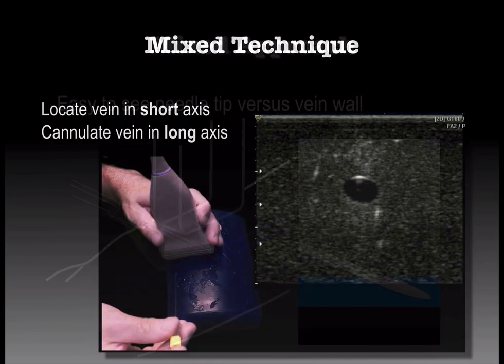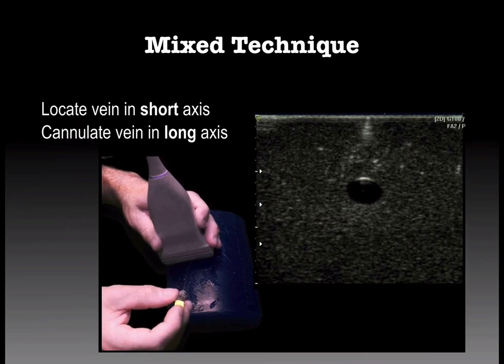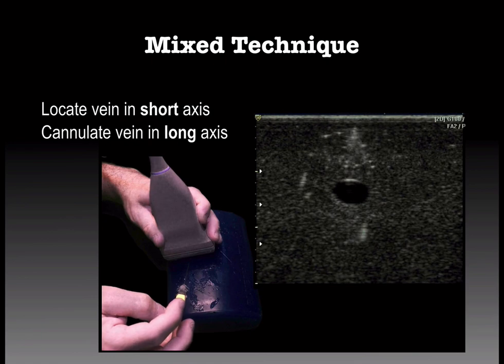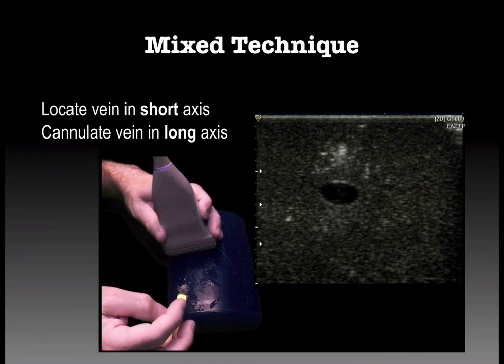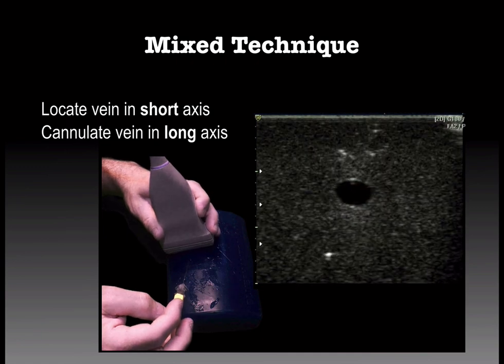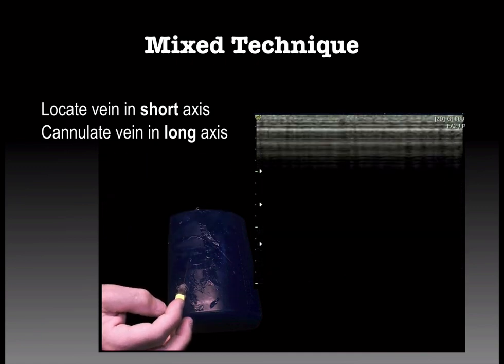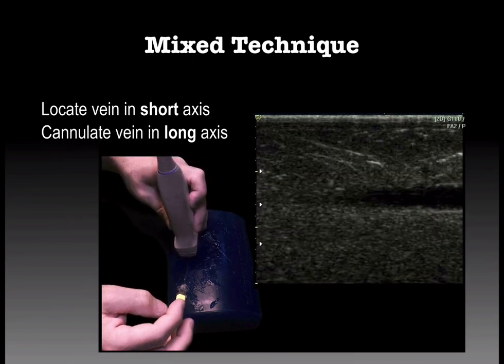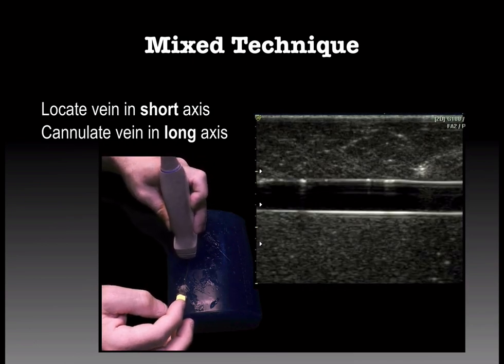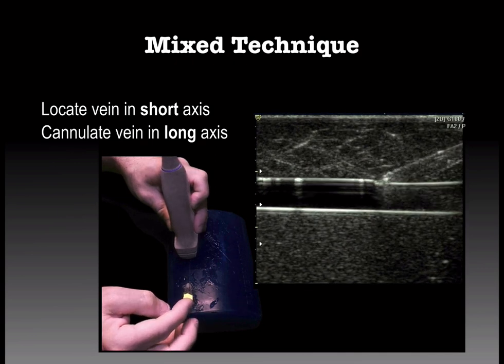Now, this is what it looks like in a phantom. We start off in short axis. We see our needle at the top of the screen. We advance our transducer until the needle disappears, then move the needle. We can redirect while we watch the needle right to left, but we don't want to see the needle move without it popping into view. So once we're close, we can turn our probe long axis, find the needle, don't care about the vein, find the needle points at the vein, and then we can finish it off.